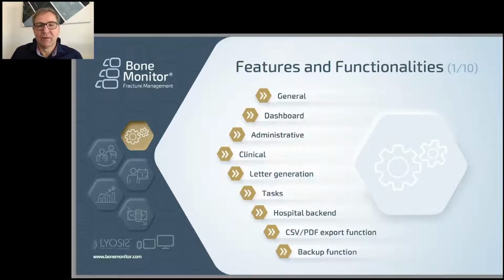Overall, we have a dashboard, we have an administrative portion of the software, we have clinical assessment data, we have letter generation, we have a task list, we have hospital backends, a lot of CSV and PDF export functions, and for sure we have a backup functionality.